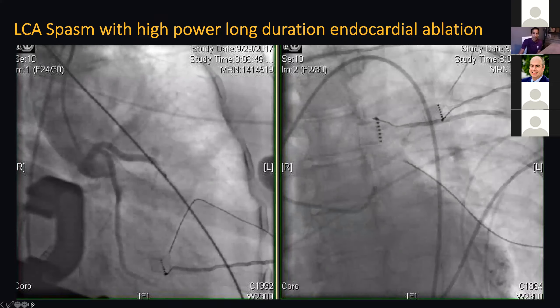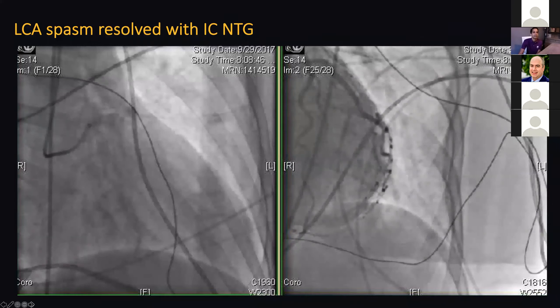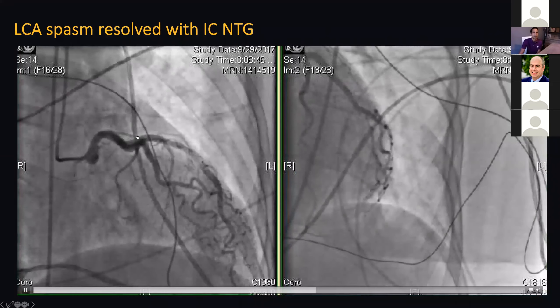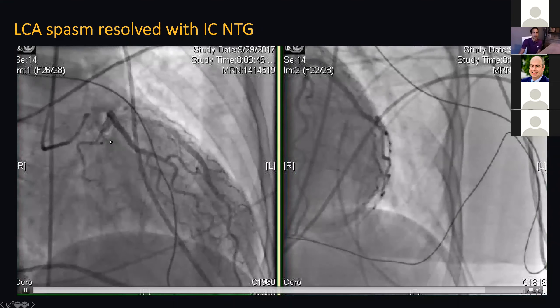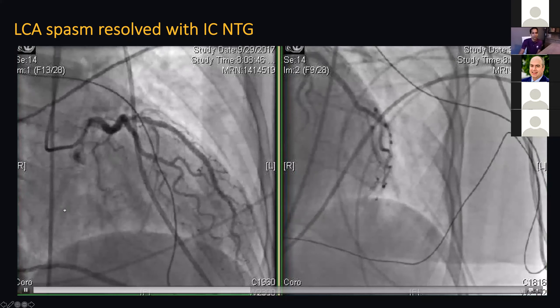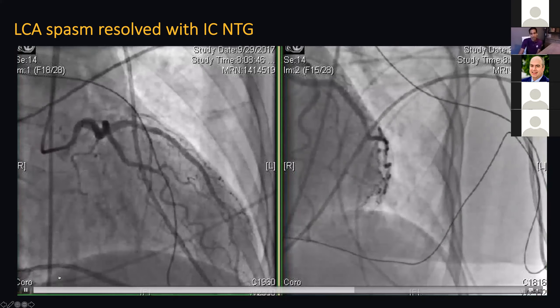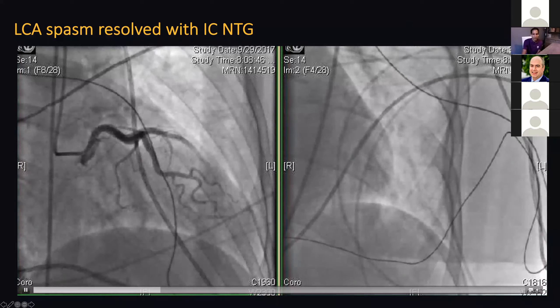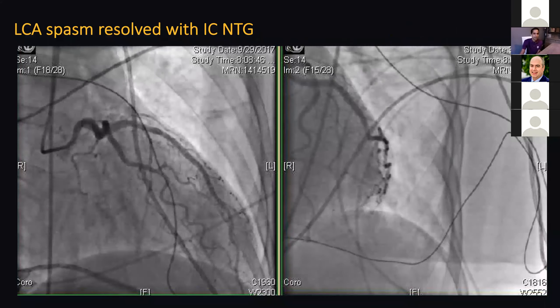This was just an LAD spasm we realized. We gave intracoronary nitroglycerin and it resolved almost immediately in this particular case.